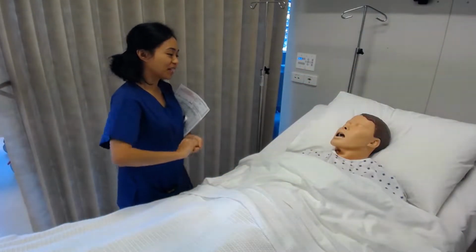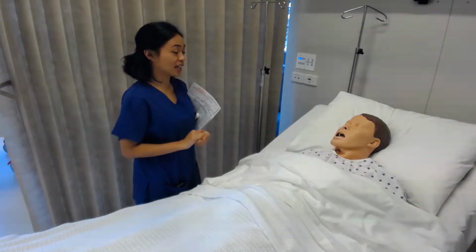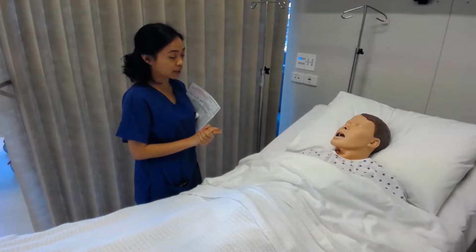Good morning, Mrs. Chu. My name is Charmaine. I'll be the nurse looking after you this morning. The time is now 5:30 and I've spoken to Dr. Jones and she's happy for us to start you on some IV antibiotics. She saw you earlier and she's spoken to you about that, I believe.